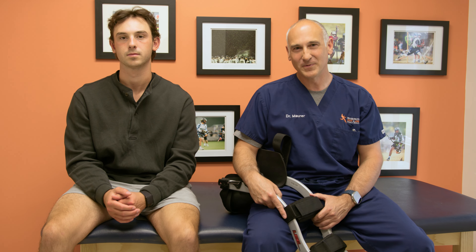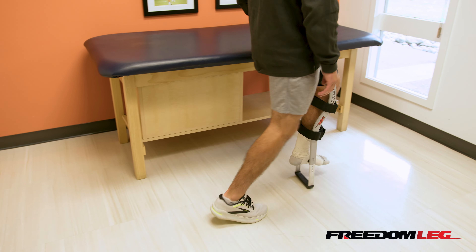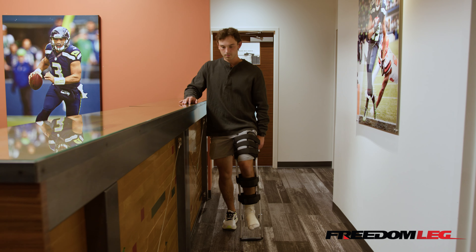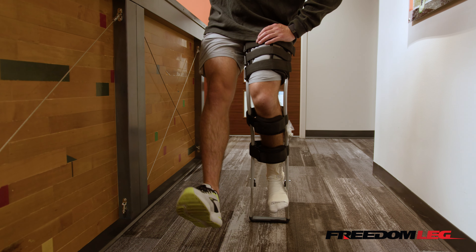Welcome to the fitting portion of the video. Before we get started, we're going to set you up for success. Make sure you've got a room with plenty of room, and then make sure you've got something to hold on to — maybe a couch, a table, or a railing — so that you can practice moving around.